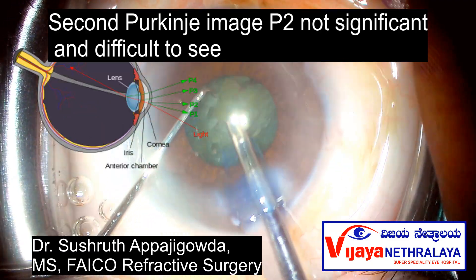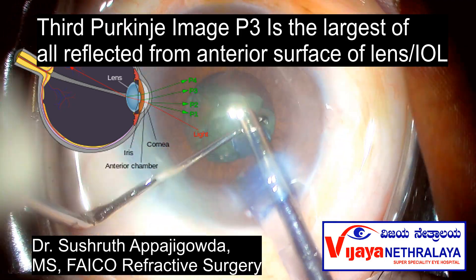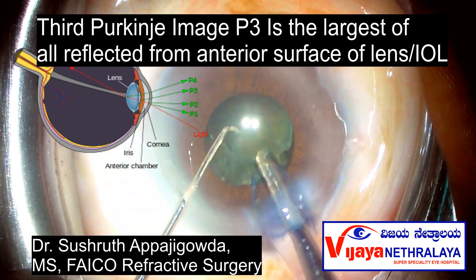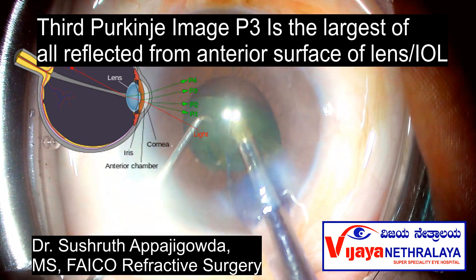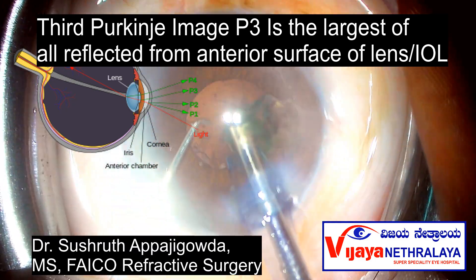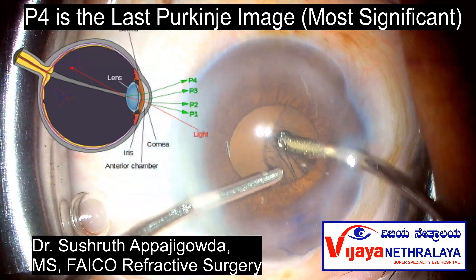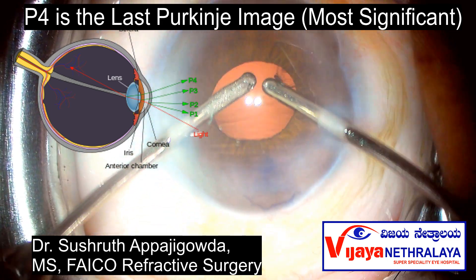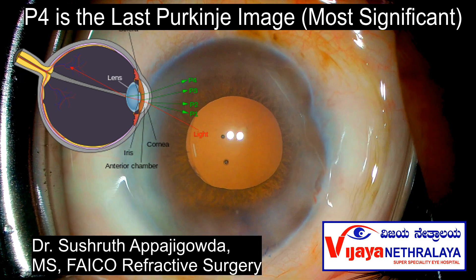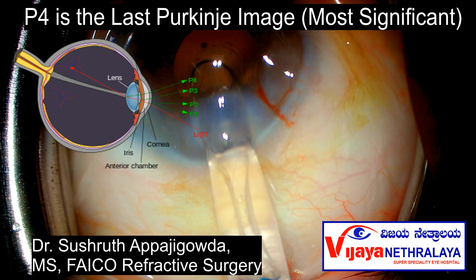The third Purkinje image P3 is the reflection from the anterior surface of the lens — this can be the crystalline lens of the eye or an IOL. Usually P3 is the largest of the Purkinje images. The fourth Purkinje image P4 is the reflection from the inner or posterior surface of the lens. Unlike all other images, P4 is an inverted image.